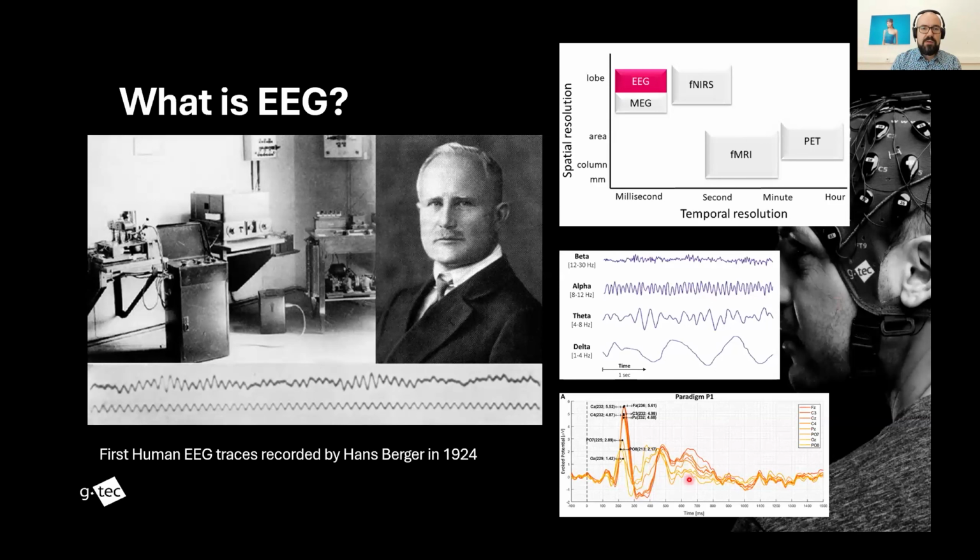Another very important thing that you can reach with the EEG are obviously the evoked potentials. And here we're talking already about the temporal resolution, where EEG is superior to most of the other imaging methods. You can detect very tiny changes in our cortex just by having an evoked potential or having an event marker, and measuring how much time after this event marker, which can be a stimulation or a task, our brain takes to react.